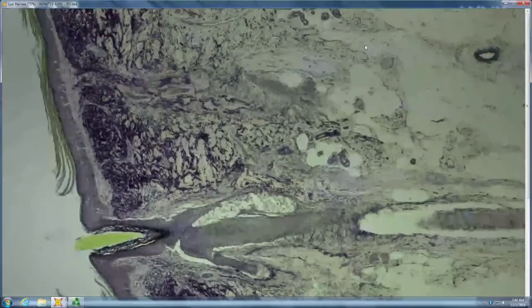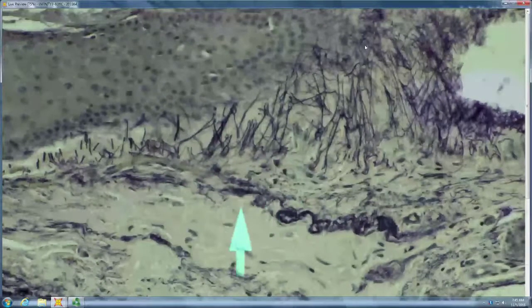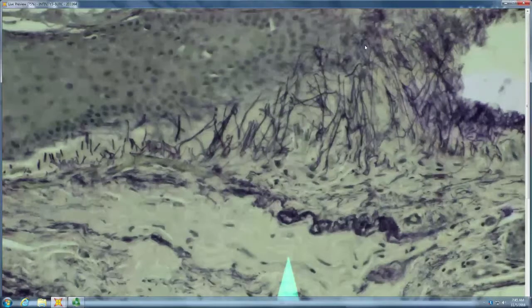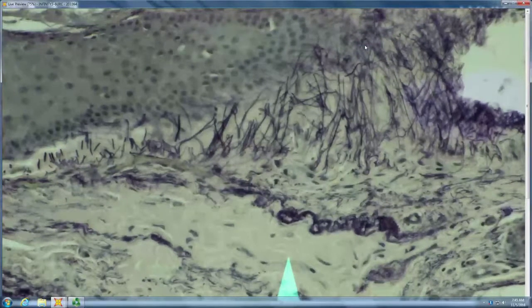And then you have normal fibrous tracts that are not scarred. This shows you the normal elastic sheath. So around hair follicles, you normally have a very thick sheath of elastic fibers. And this shows you how they condense into a sheath that lines the outside of the hair follicle. When the hair has involuted, that sheath remains like a sock without the foot in it, right? And damage to that sheath is evidence of a scarring alopecia.